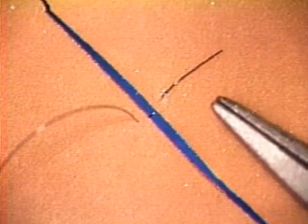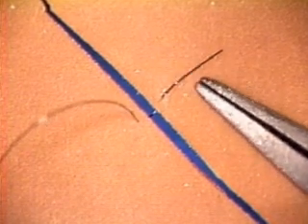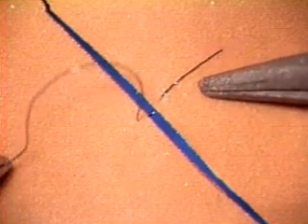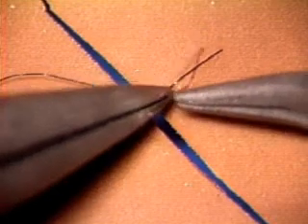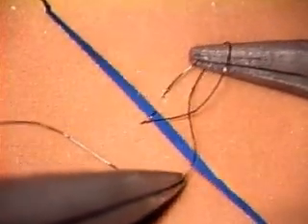Here's how to avoid these problems. First, look and see if you'll be able to pick up the short end. If not, then make the necessary adjustment so you can pick it up. Then make the loop. Then pick up the short end. That's the second big trick. It's really that simple.